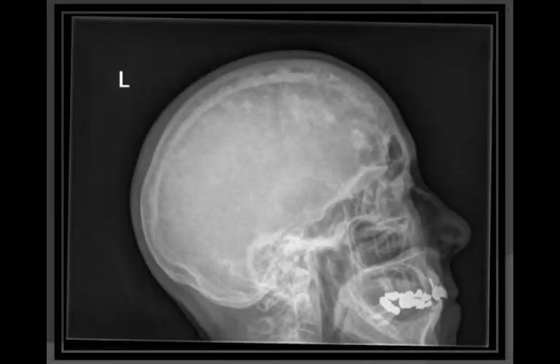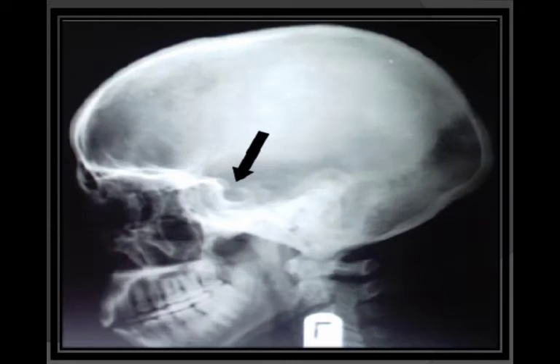Here indication of lateral cephalometric for any condition that affects the skull, like in this image, which is Paget's disease. It is a chronic disease, an abnormal process that causes excess breakdown and regrowth of bone, so the bone here becomes bigger and softer than normal. Here we have lateral cephalometric for the sella turcica, clear in this image.